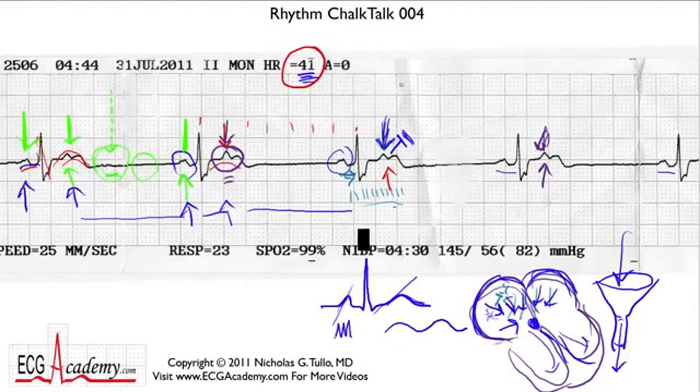These Chalk Talks, as I said, are designed to get you looking at things that you normally won't see in a textbook, and to get you comfortable with reading more difficult tracings. So I hope that helped.